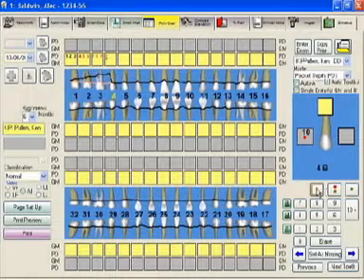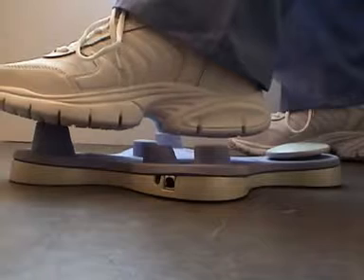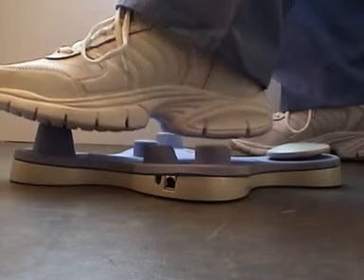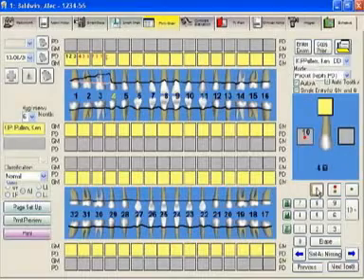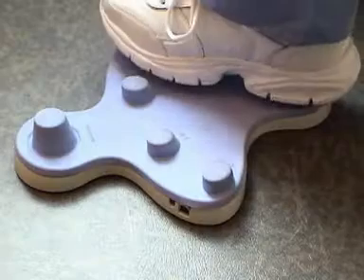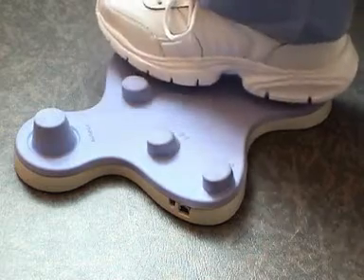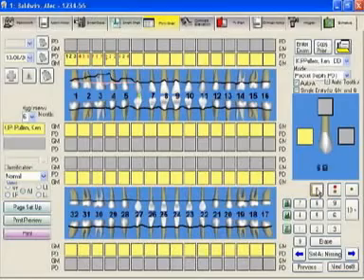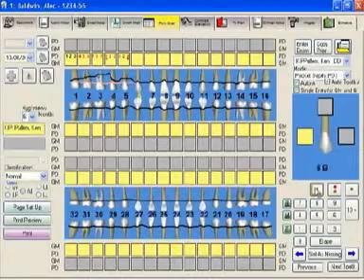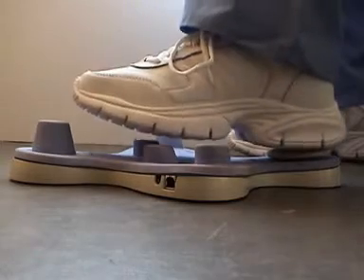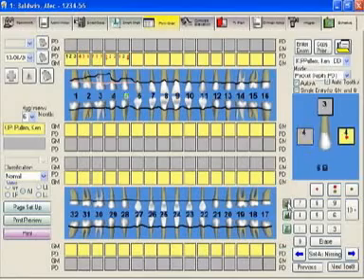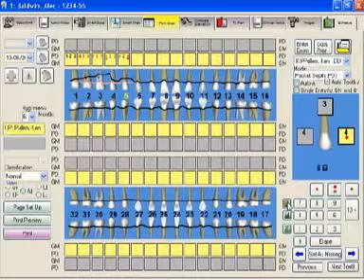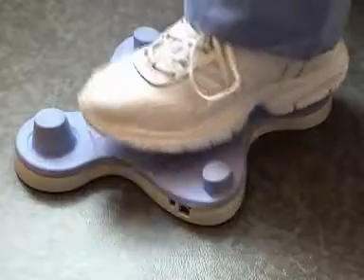So say you're going along and you have a four, three, four with two millimeters recession and bleeding. I can also mark my recession and the bleeding at the same time. So if my mouse is on the bleeding there, I'm going to just hit my four, three, four and I'm going to rock back on my heel, which is going to mark my bleeding. And then if I have recession, I just mouse over with my toe to the R and I'm going to heel click and I'm going to add my millimeters of recession. Maybe I've got two millimeters, we did two millimeters of recession, right? So I'm going to do two.